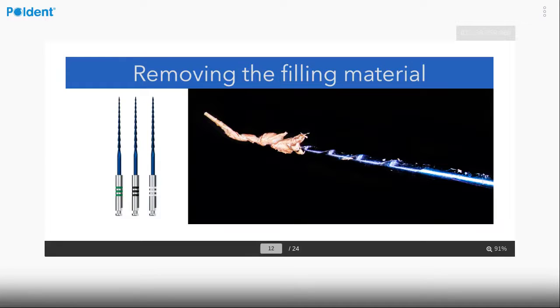And actually, in the first version of our presentation, this had to be the first case that you were supposed to see. And now the part that Mark already told you should start right now. So now you have to remind all the things that Mark said, and he had beautiful images of removing gutta percha.